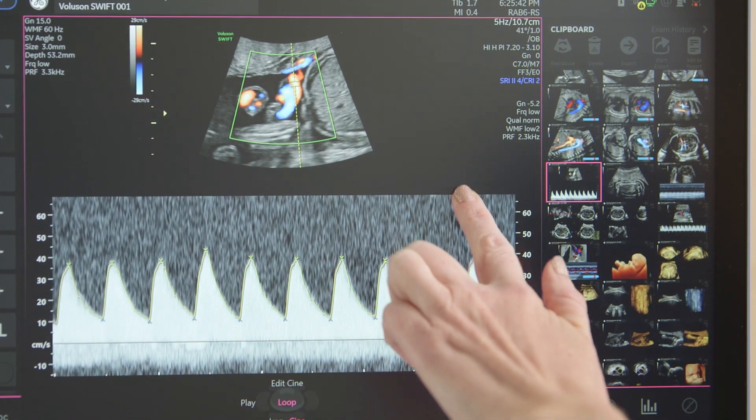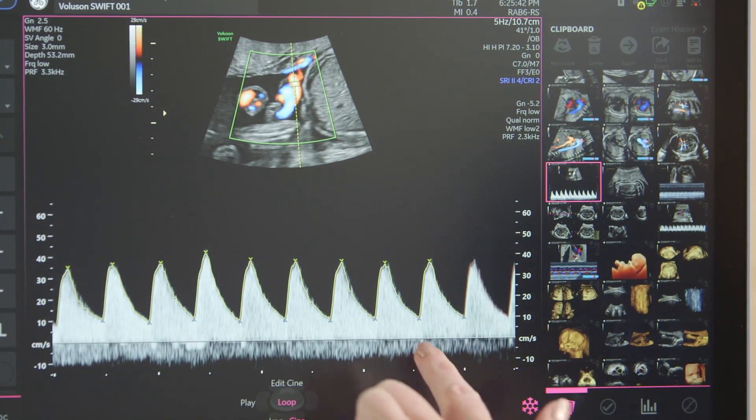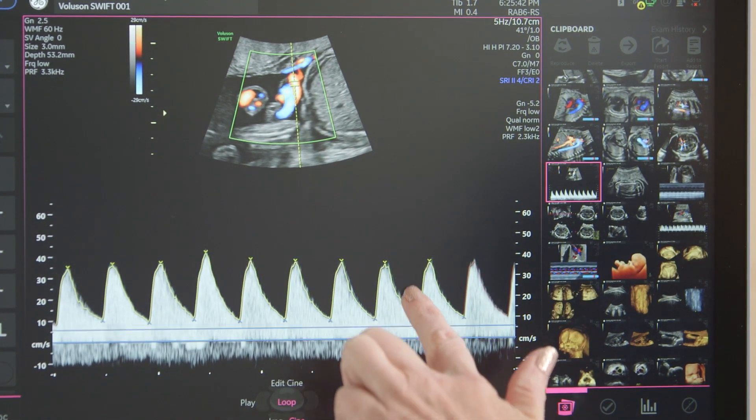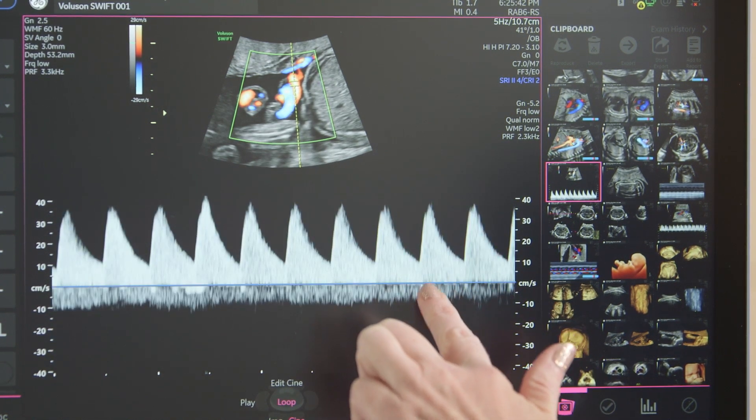Pulsed Wave Doppler controls include gain, gate position and size, Doppler angle, and baseline.